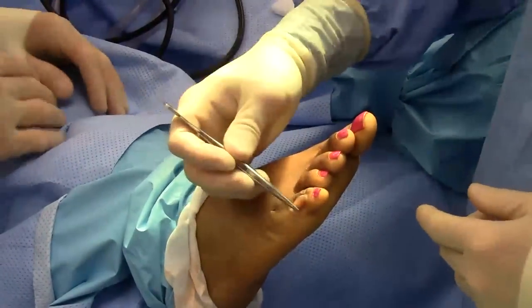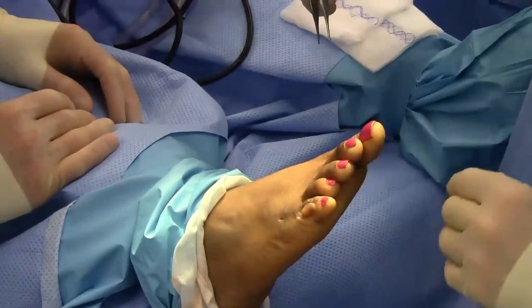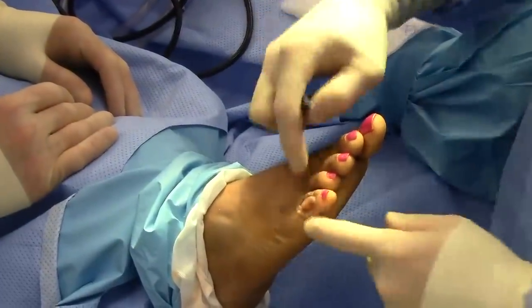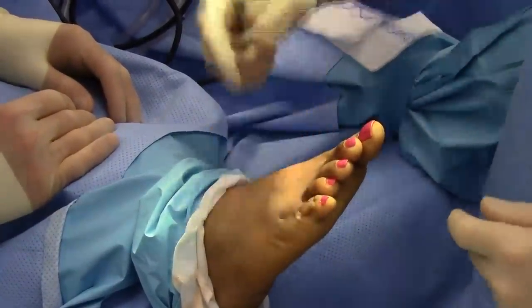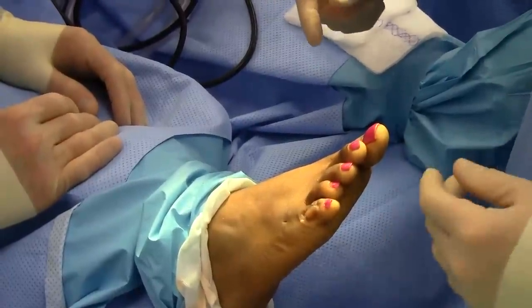The implant has been placed into the joint. The toe is rectus — it has a nice position and there are no external K-wires. Once we sew this up, it'll heal from the inside and look really good for years.